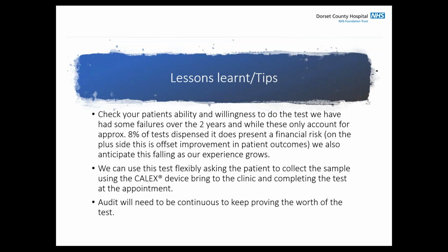So we try and use our test flexibly. Sometimes we have some patients who perhaps aren't as able on the mobile phones. We do have some older folk on the phones as well. We have a large retired demographic in our area as we live down by the seaside. But we also have some folk that just really can't get on with the phone side of things. So what we do is give them a kit, ask them to bring us back the whole kit, including a collected sample, using the Calex device. And then the nurses in the clinic carry on the second part of the test using the camera and the phone.